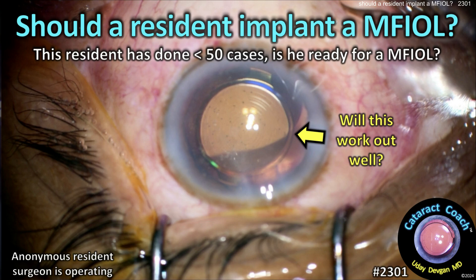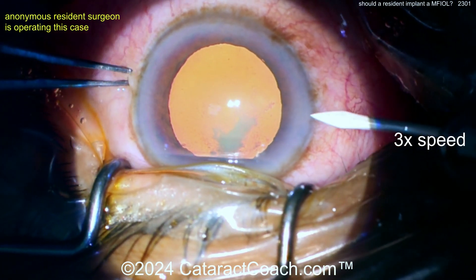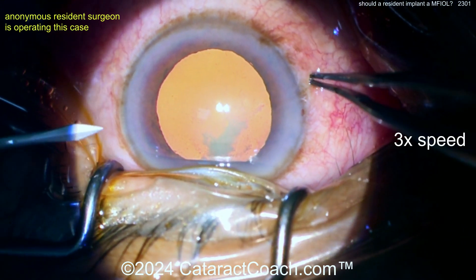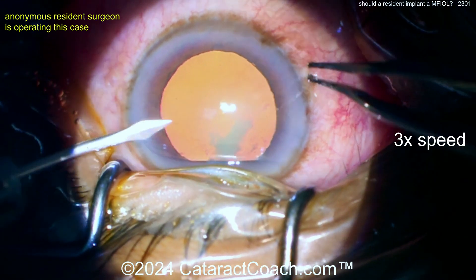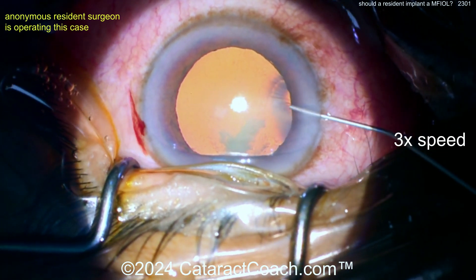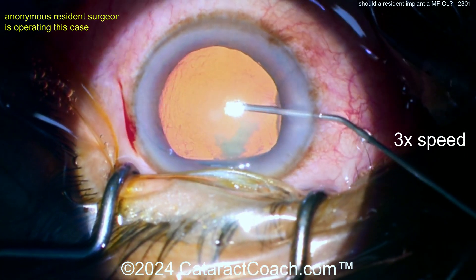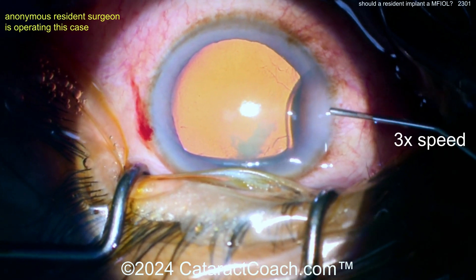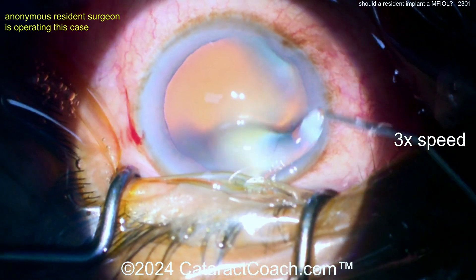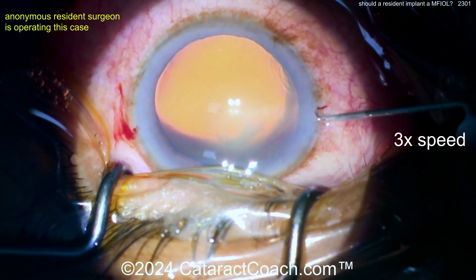CataractCoach.com: should a resident implant a multifocal IOL? This resident has done less than 50 cases — is he ready for a multifocal lens? A young doctor sent me this video and asked for my opinion on how the case is and what can be done to improve. We're showing the video at three times normal speed. The surgeon is sitting superiorly, there is a speculum, the lid margin is draped and covered appropriately, and eyelashes and lid margin are sequestered — that's very good.